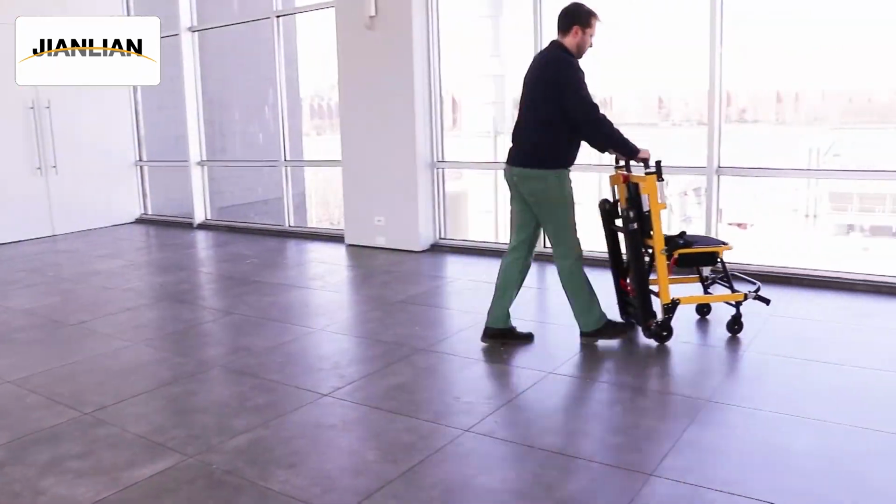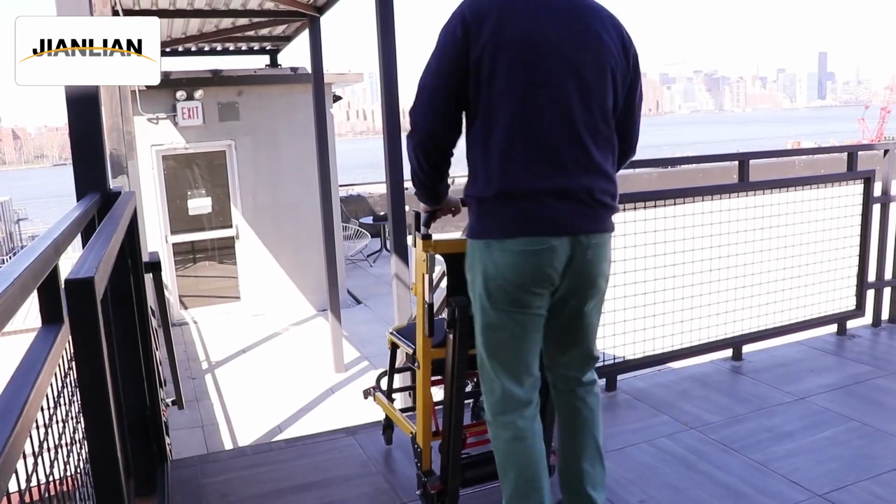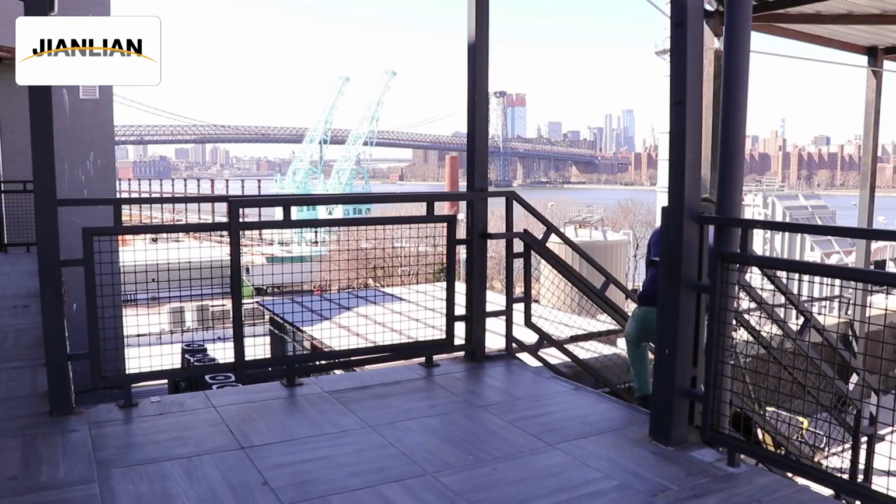We recommend familiarizing yourself with the stairlift by practicing on flat ground, then ascending and descending stairs with no rider. This will ensure your safety and the safety of the rider.